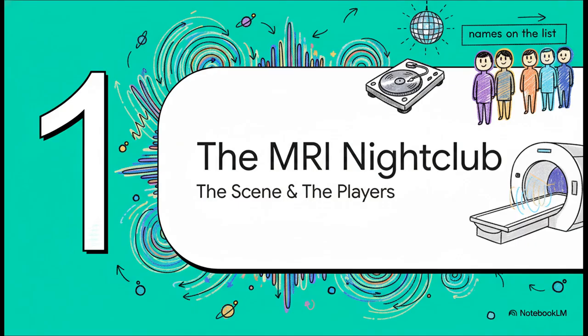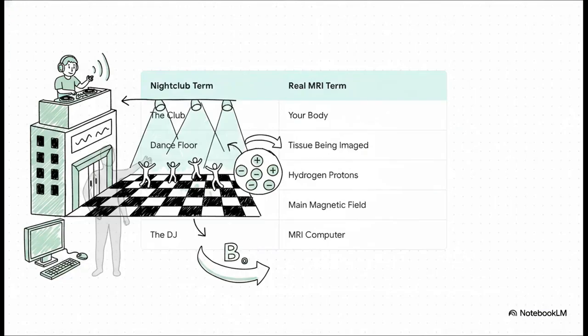Before the music really kicks off, we gotta get our bearings. We need to understand the scene and who's who. Okay, let's break this down. First up, the club itself. That's your body, the whole building. Now, the specific dance floor we're interested in tonight, that's the part of your body being imaged, like your knee or your brain.